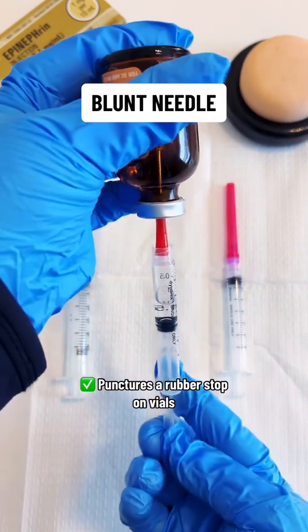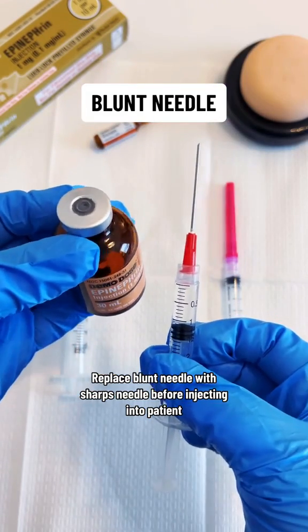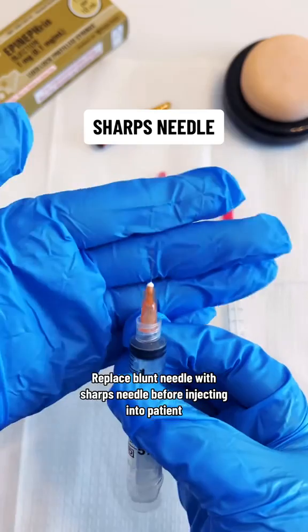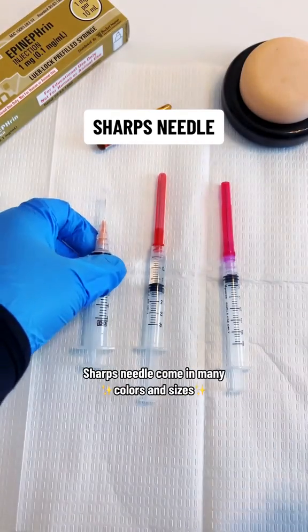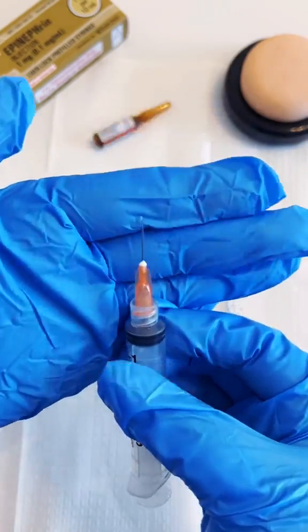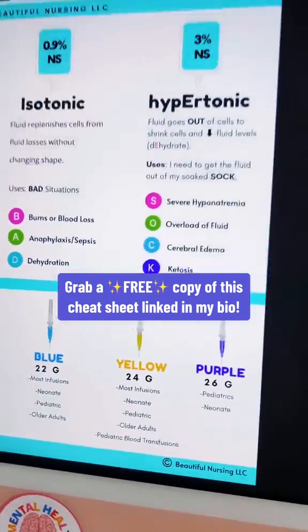Once you get the medication out into the syringe, replace the blunt needle with a regular or sharps needle, which has a beveled tip that makes it much easier to puncture the skin. These regular or sharps needles can come in many colors and many sizes, and are always used to inject into your patient. Just remember: the higher the gauge, the smaller the needle.